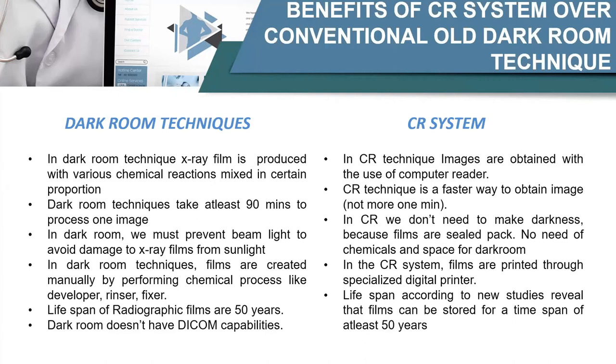In darkroom, we must prevent sunlight from coming inside, because it can damage our image quality. In CR system, we need a very small space where we can keep our reader, our computer and a UPS. That's a very small space usage. Next point is that in the darkroom technique, we have to go through certain procedures like developing, rinsing, fixing.